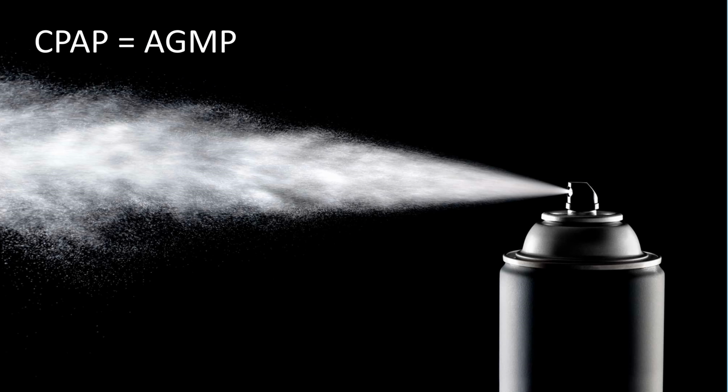As a final note, CPAP is still considered an aerosol generating medical procedure. However, in the 11th hour before I was able to get this video out, we were informed that PPE guidelines for AGMPs will be changing with the CPAP updates on May 15th. The updated document for AGMPs has not been uploaded to the Coming Soon folder, so please make sure to review it when it is released on May 15th. The notable changes in the document include acknowledgement that COVID is not the only transmittable respiratory illness that healthcare professionals come into contact with, and a relaxation in required PPE for AGMPs.